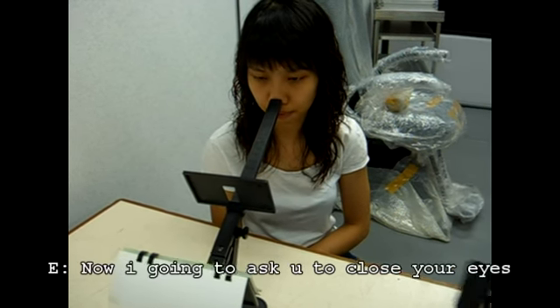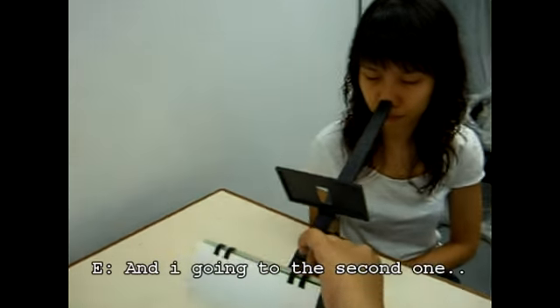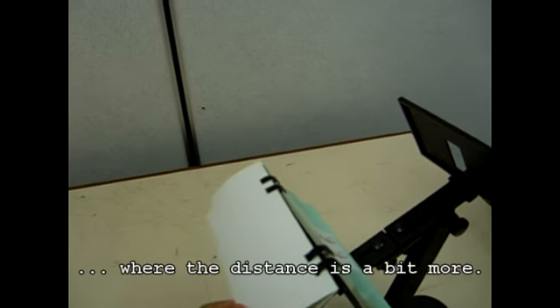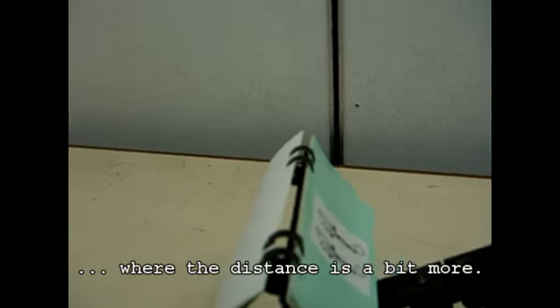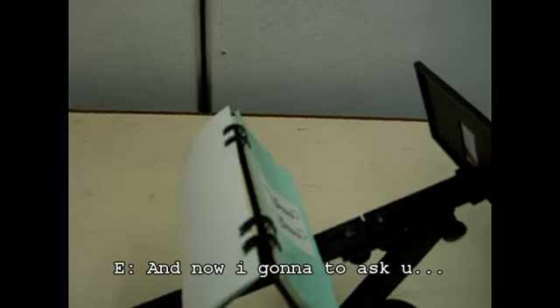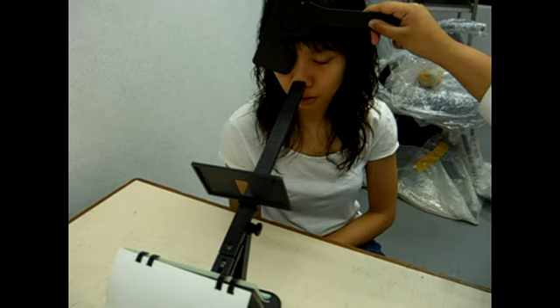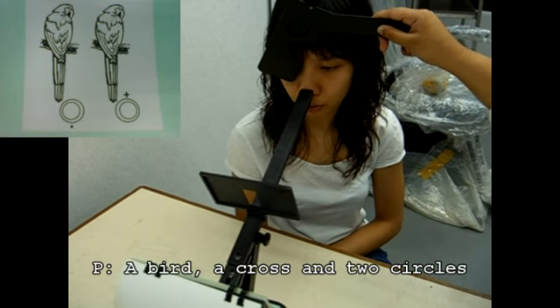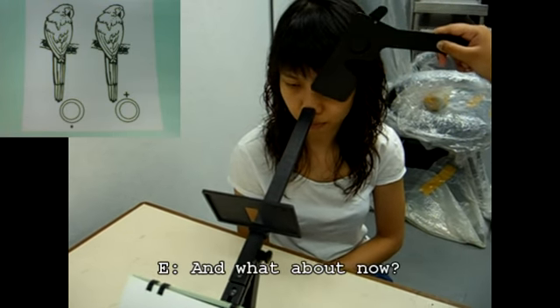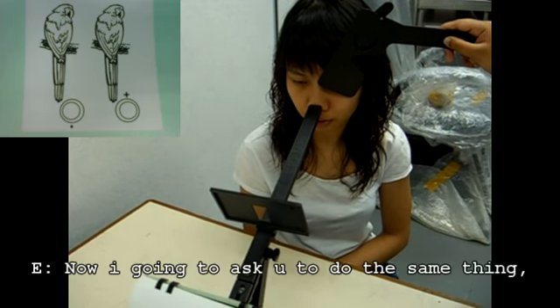Okay. Now I'm going to ask you to close your eyes, and I'm going to go to the second one, where the distance is a bit more. What can you see right now? A bird, a cross, and 2 circles. And what about now? A bird, 2 circles, and a dot.